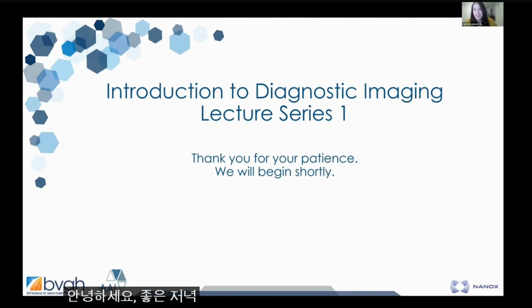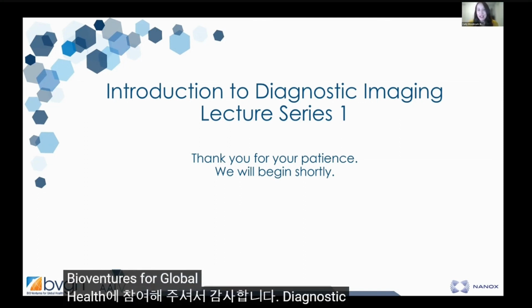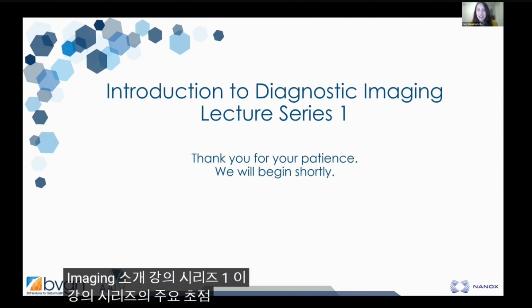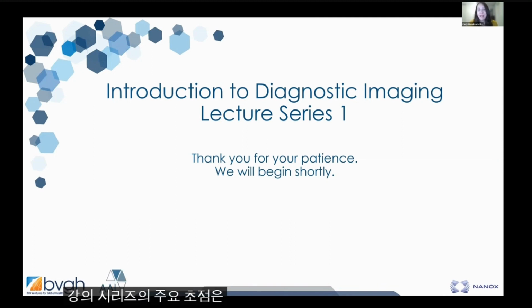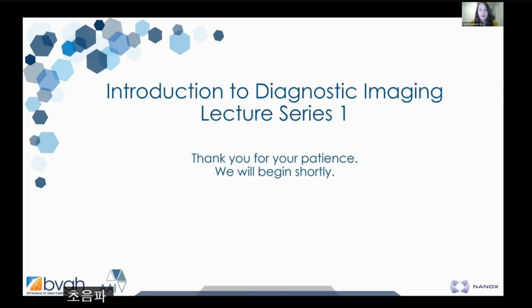Good afternoon and good evening. Thank you for joining BioVentures for Global Health's Introduction to Diagnostic Imaging Lecture Series 1. The primary focus of this lecture series is to strengthen capacities in diagnostic performance and image interpretation across the most common diagnostic imaging pathways. In this series, we'll be addressing various topics in ultrasound, X-ray, CT, and tomosynthesis.